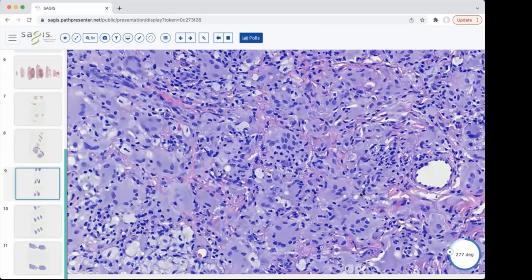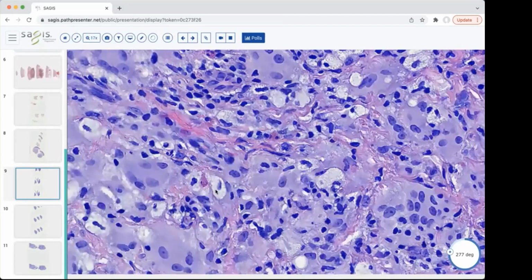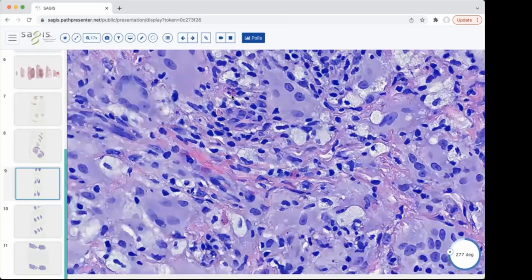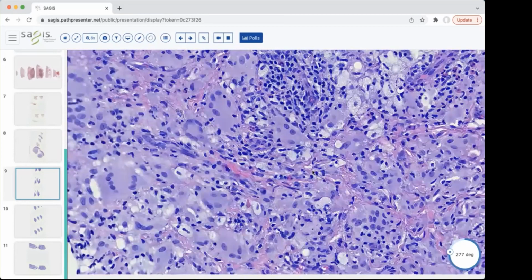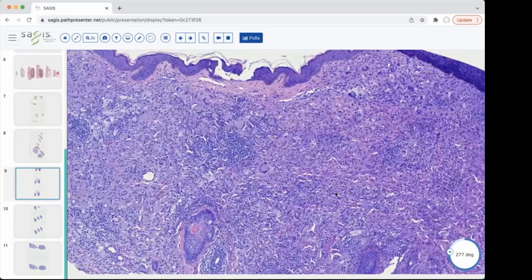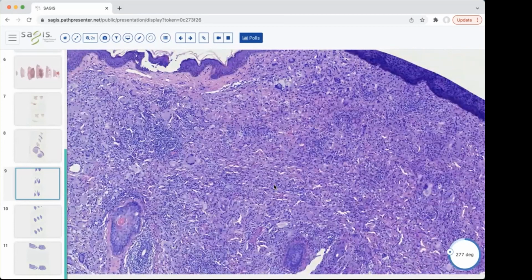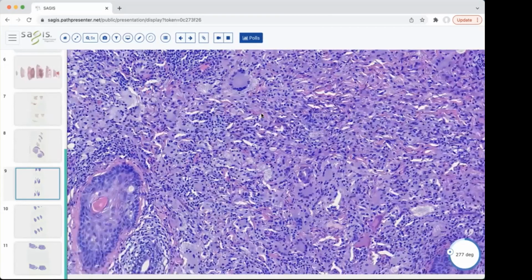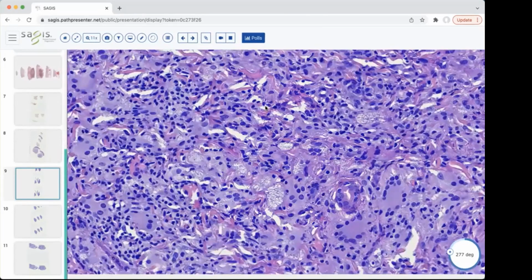So this diagnosis is xanthogranuloma. We sort of name them differently if it's a kid or a child or if it's an adult. And then scattered oftentimes in these, you'll have eosinophils, which you can sort of see here, and here as well. Xanthogranulomas are often just one solitary lesion. If there's more than one, then you can be worried about other things, but usually just one. I think more commonly in children, but we clearly see them in adults pretty often too. And this is a nice example of that.